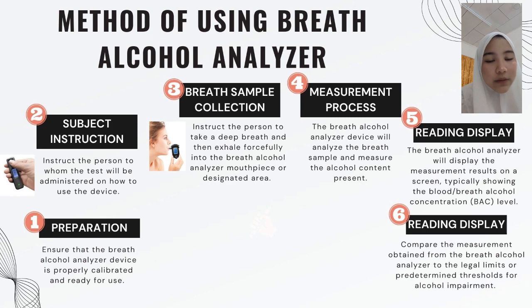Next is measurement process. The breath alcohol analyzer device will analyze the breath sample and measure the alcohol content present. The specific method and technology used will depend on the device, but generally electrochemical or infrared sensors are employed to detect and quantify the alcohol.